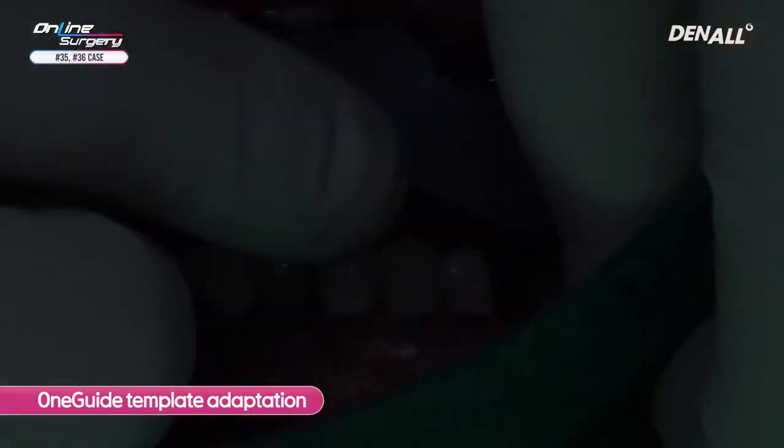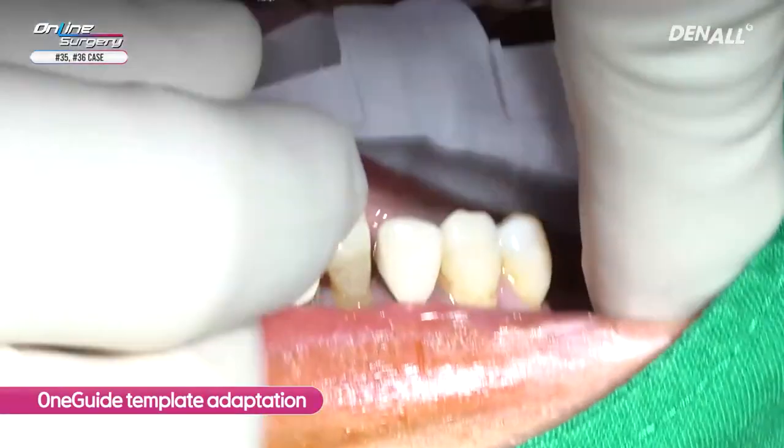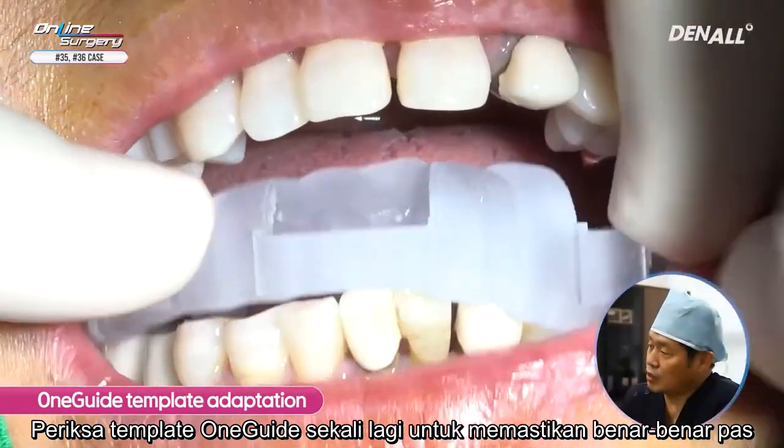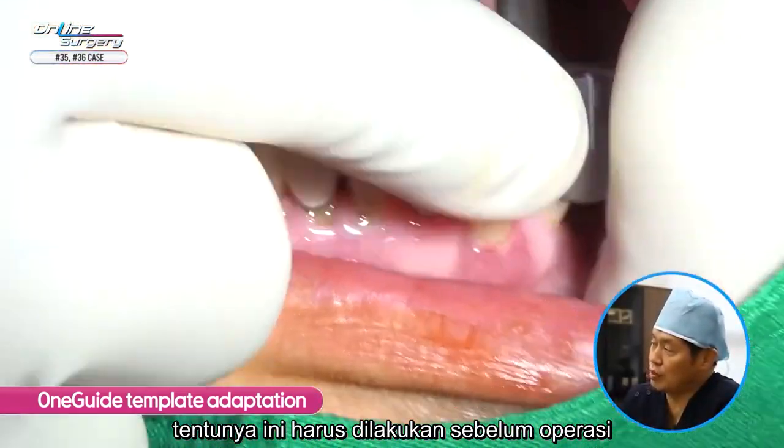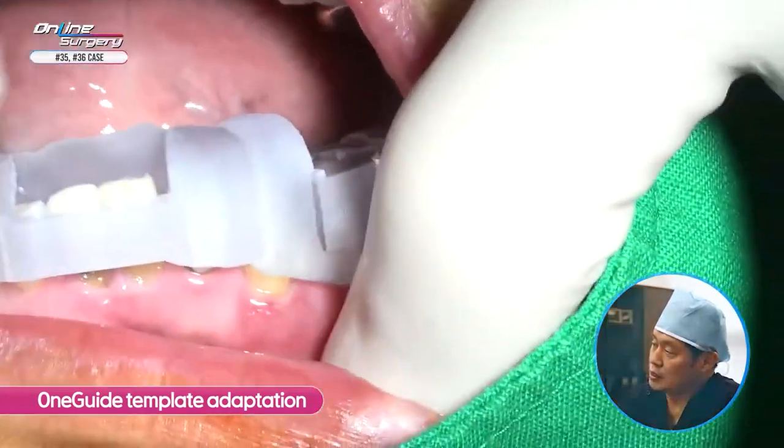OneGuide template was checked once again to see whether it fit well. Of course, I also did it before surgery.